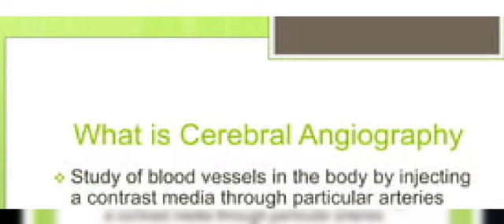Actually, this angiography method is administered only under the guidance of a team: an interventional radiologist, anesthetist, cardiologist, radiological technologist, physician, and nursing assistant. In cerebral angiography, we will be imaging the intracranial arteries, and there will be catheterization, that is the insertion of the catheter into the selected vessels.